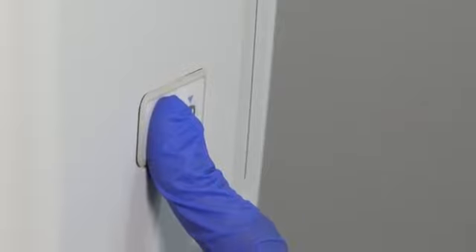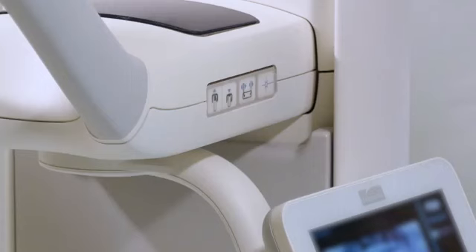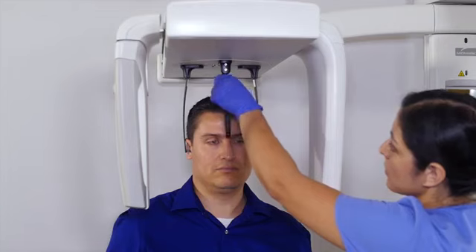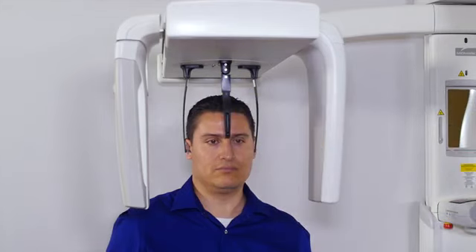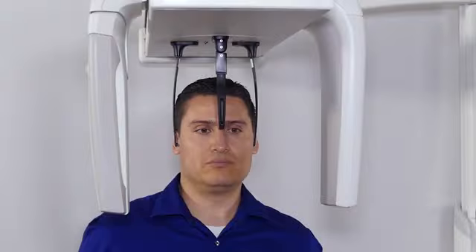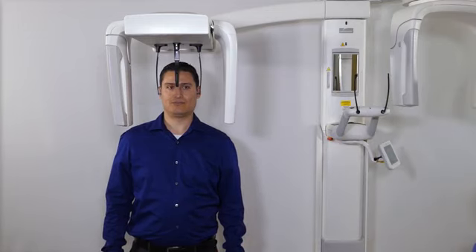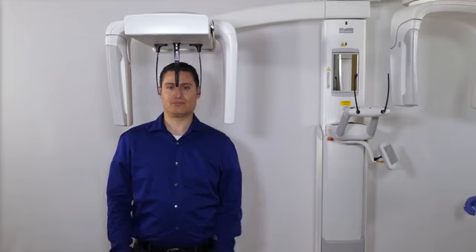Using the up-down control buttons on the secondary collimator or on the side of the patient positioning table, adjust the height of the Vantage system until the ear posts are approximately level with the patient's otic canal. Grasp the nasion marker and slide it vertically until it aligns with the bridge of the patient's nose. Slide the nasion marker toward the patient's nose until the tip contacts the bridge of the nose. For projections where the nasion marker is not needed, it will rotate about the base out of the projection area.